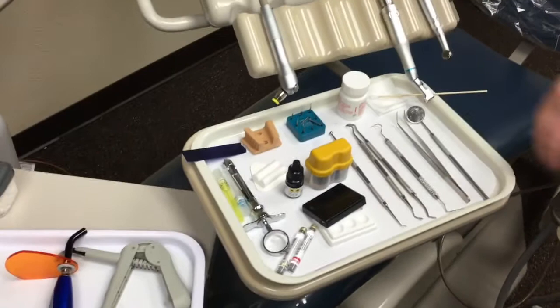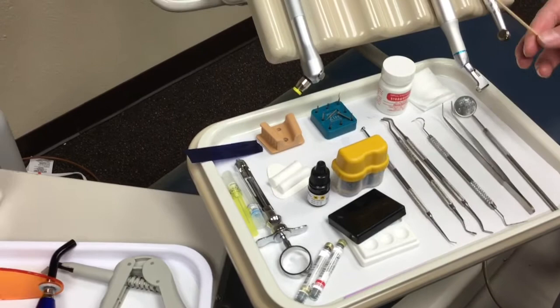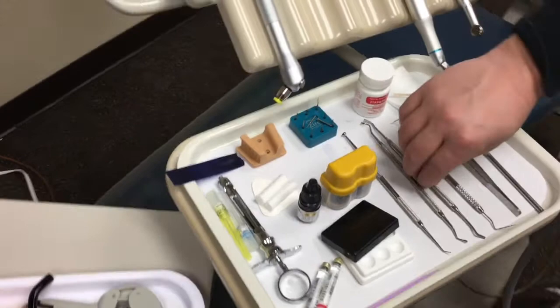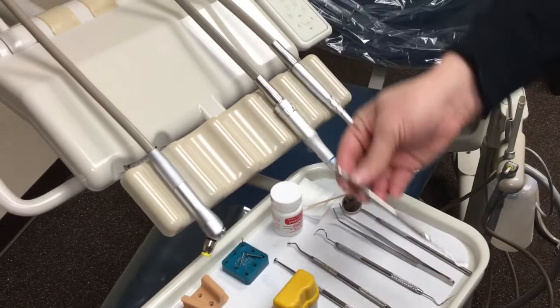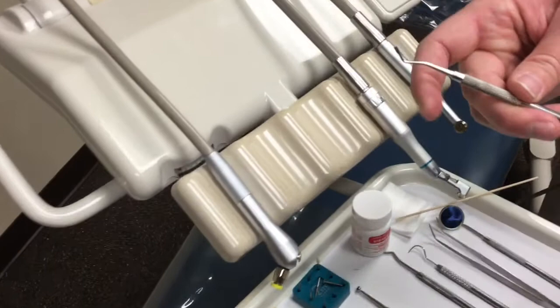The next things on here are going to be the topical anesthetic — in this case we have a delicious strawberry. We also want to make sure that we have some two-by-twos and a cotton swab, which will be used to apply the topical anesthetic. As far as the rest of the hand instruments go, we have our plastic instrument. There's a flat curved edge on one side and then this one kind of goes more horizontal in a curving L-shape — that is what's called a plastic instrument. Next we have a condenser, sometimes called pluggers. You can see the cylindrical shape on the bottom — they come in all different sizes.